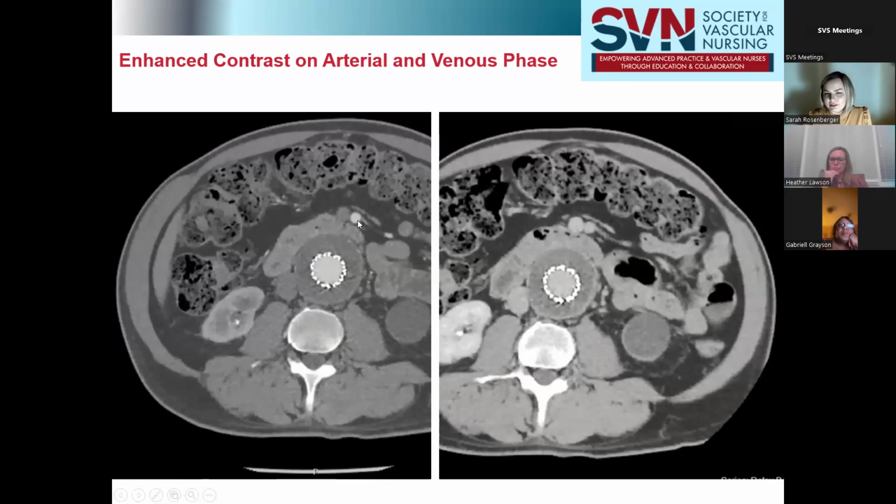You'll also see mesenteric artery and vein. These light up the same. So some of these images will look different. What you're looking for when you're looking in the sac is to see that there's no contrast dye inside the sac, whether it's arterial or venous phase.